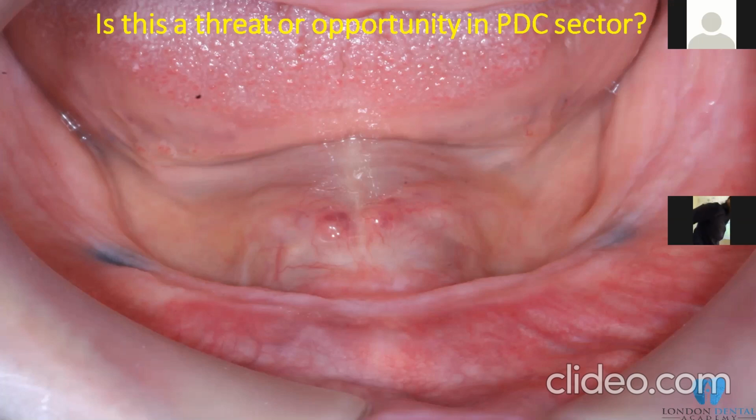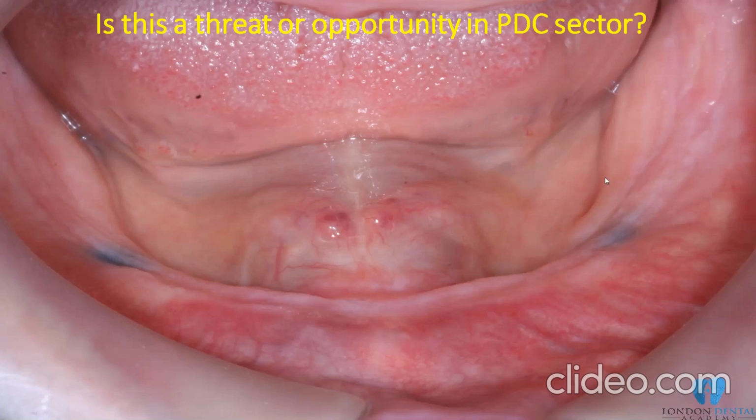Now, if you look from the outset here, looking at the corner on the left and right hand side, sometimes you won't get the retention you're looking for, because you can see a little bit of undercut. My advice in these cases is that you need to get your finger down there. You need to push your impression material, whether it's a primary or secondary impression, but here I would probably be talking about the secondary impression when using the green stick.